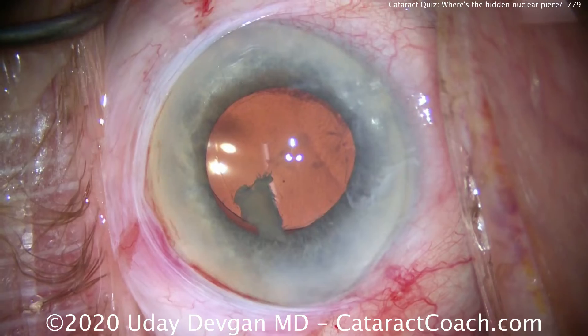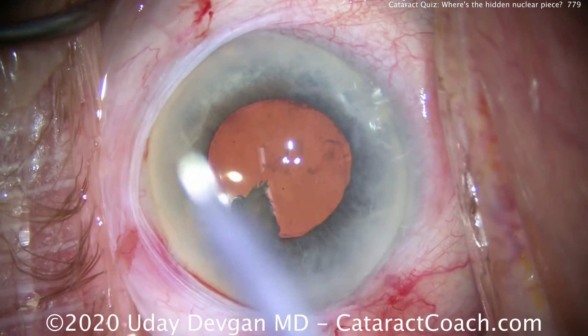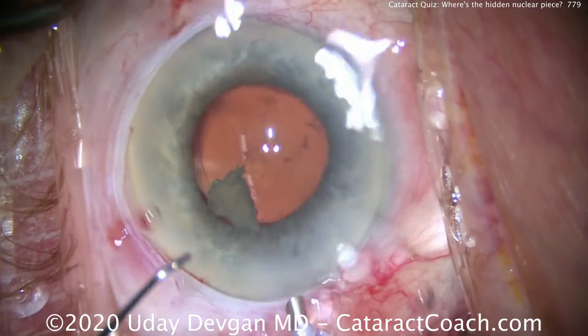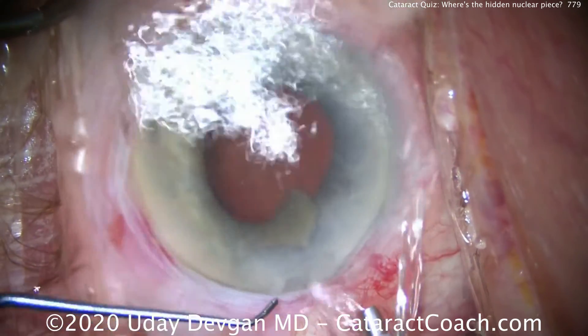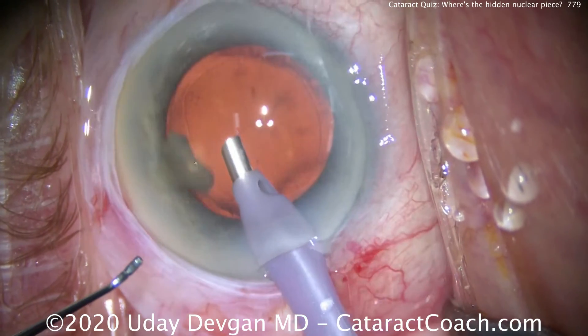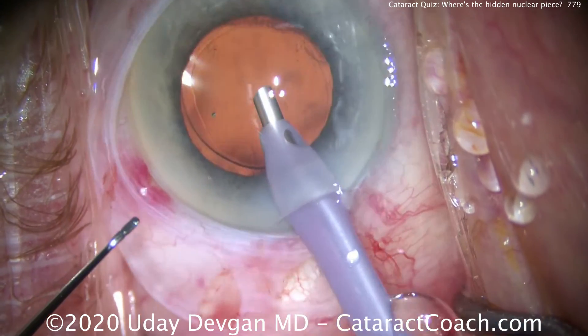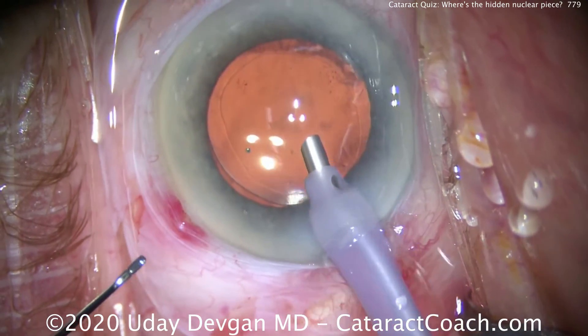The easiest move is to go back in with the phaco probe. We can't irrigate it out, so the phaco probe is being set up by my technician — it has to be reprimed — and we're placing it back inside the eye. This last piece of nucleus will be emulsified very easily with the probe. A little bit of vacuum, and it goes down quite nicely. Done.